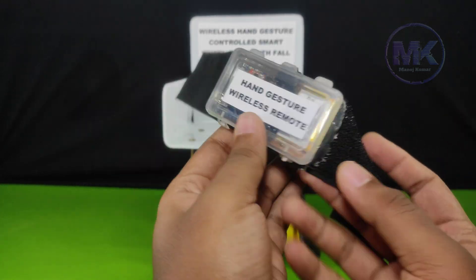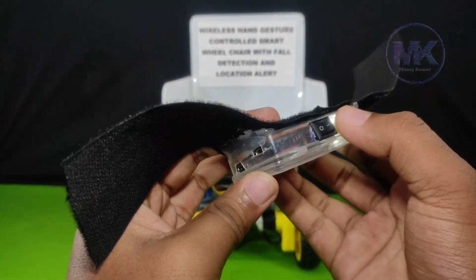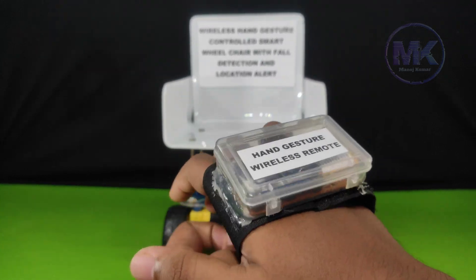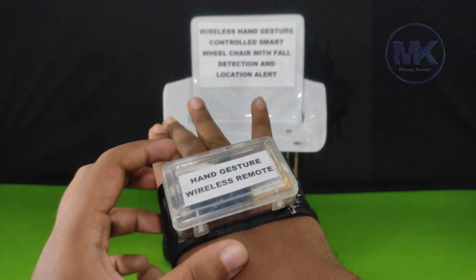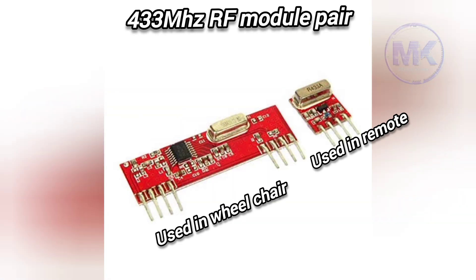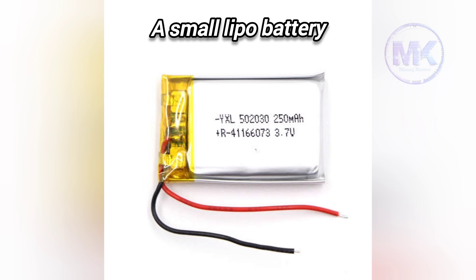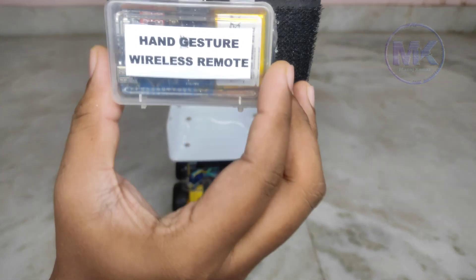The hand gesture wireless remote is a wearable device which can be easily fixed on our hand like a watch. The components used in this remote are: Arduino Nano, 433 MHz RF module pair, MPU6050 accelerometer sensor, and a small LiPo battery. Let's see how this wheelchair works in real time.